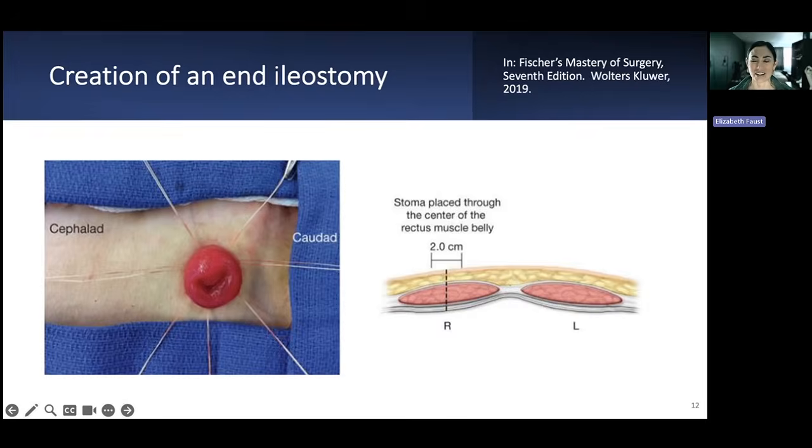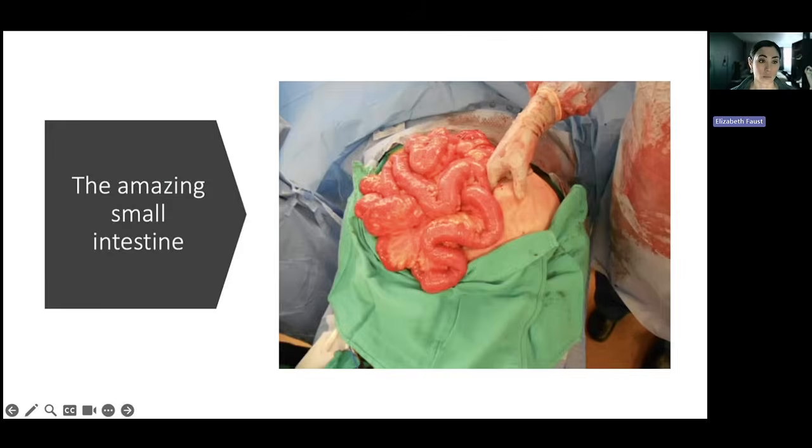I can remember Professor Brian Brooke first described this technique of brooking a stoma in order to minimize skin excoriation in 1947. And so this has been around for quite some time, and we've really come a long way, actually more so with the supplies as well.